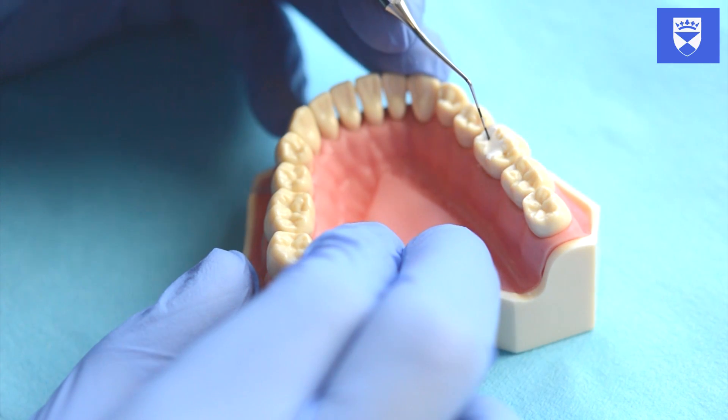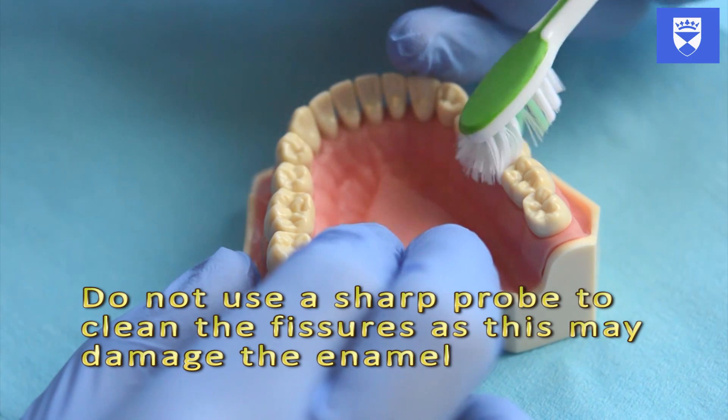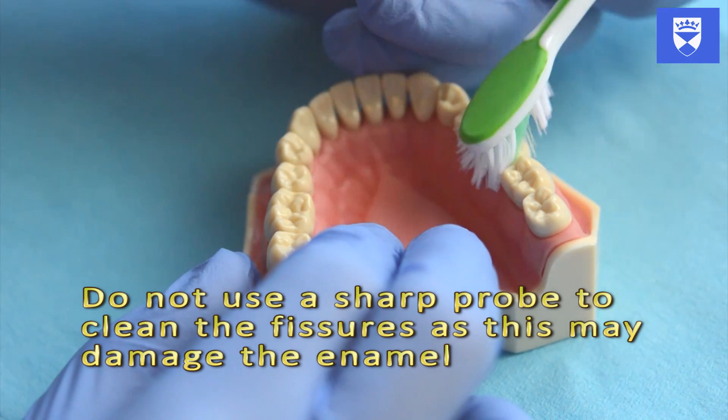If debris is evident within the fissure pattern, gently debride this with a toothbrush. Use a buccolingual orientation when brushing the surface of the tooth.